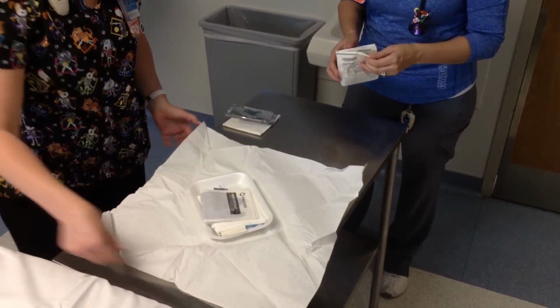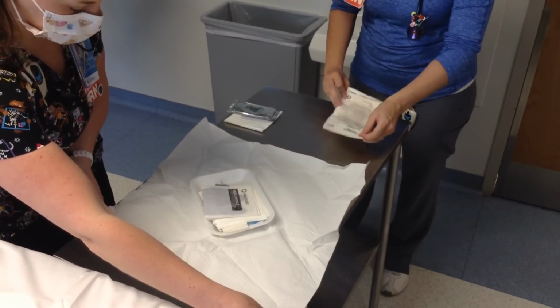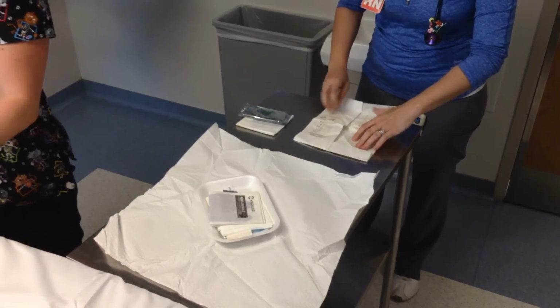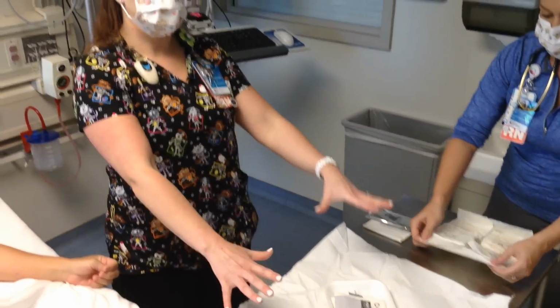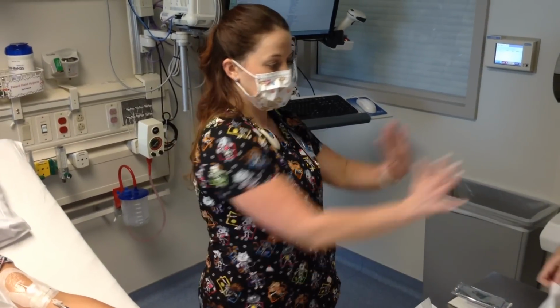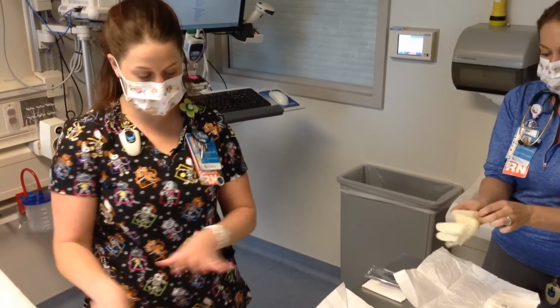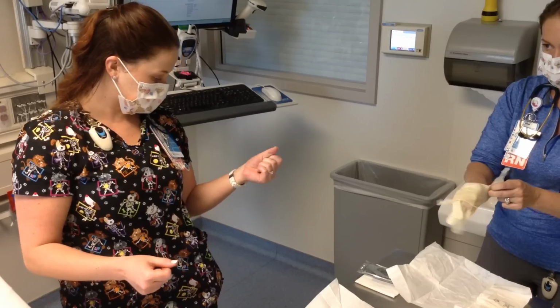Notice how I'm positioning my work field. I always like to position where I have my patient and my sterile field, and all my dirty stuff's going to go out. I don't want my dirty anywhere to interfere with my sterile field.